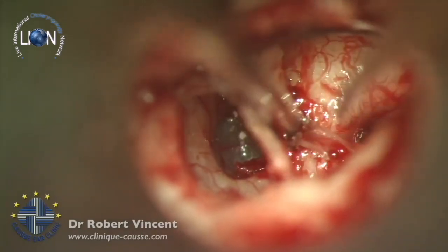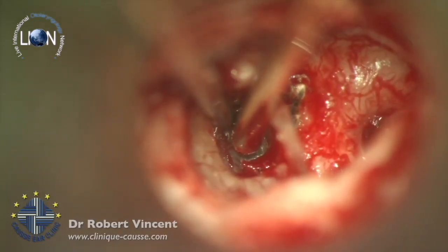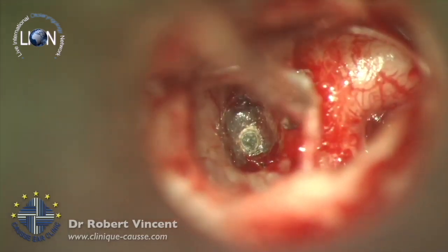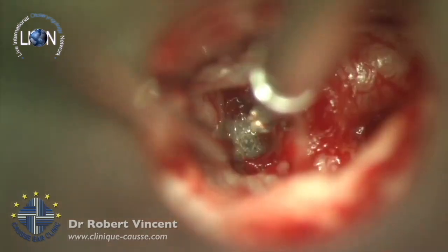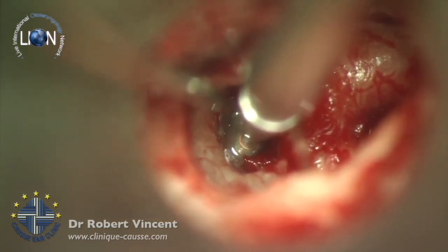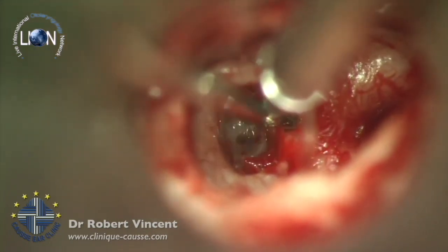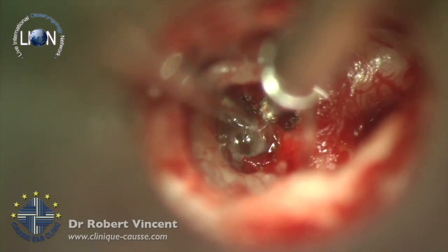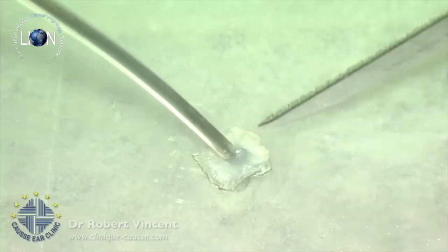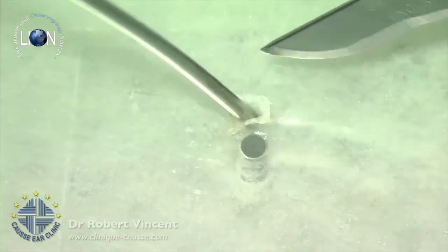I'm using the laser. And now I get a nice exposure of the footplate, so I'm going to start the process. You see, only one or two shots are enough to perform stapedotomy with this beautiful AutoLase. I'm using this Lumenis system since a few months, and I'm very happy with this. This is very safe, in fact, because we combine the safety of the CO2 laser, which is totally absorbed by perilymph, plus the safety of a handheld probe. So you see only one shot, maximum two, and then finalizing the stapedotomy with a micro drill, which is a 0.7 millimeter burr. And then I'm using, of course, the vein graft.